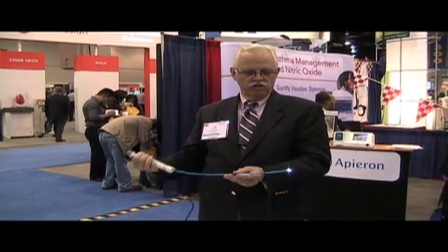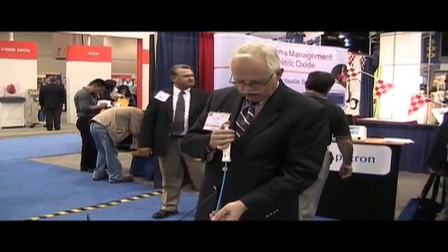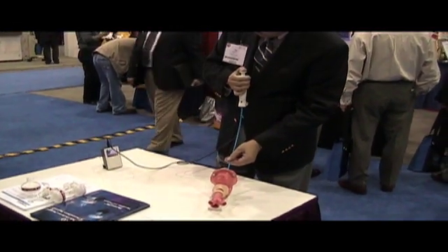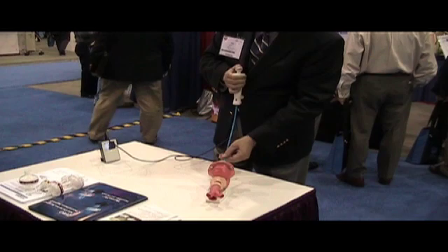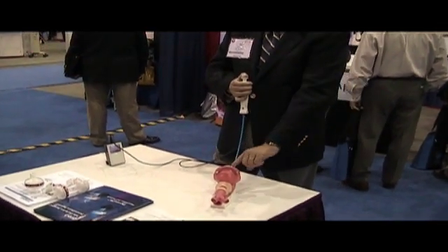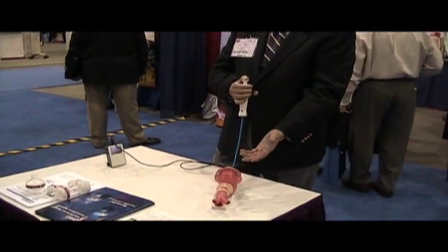On the top of this is a button and you push this button and this increases the flex. You can see that the device is flexing and makes it easier for you to intubate the patient. You look in the monitor and follow the patient, flex this so that you can see the cords. As you go through the cords, the endotracheal tube is slid off of the device and you inflate the cuff.